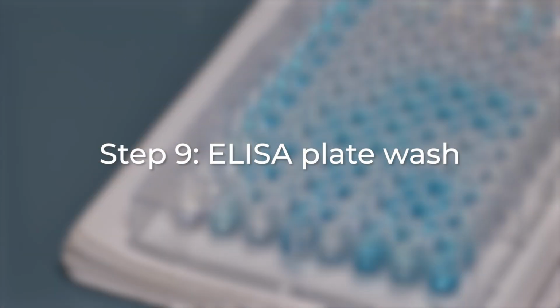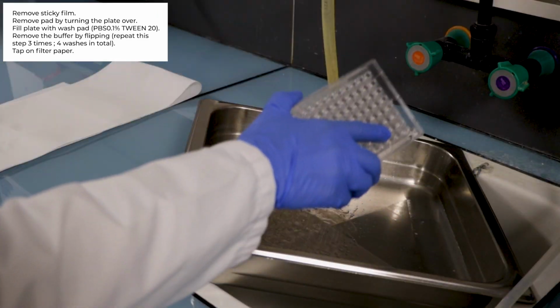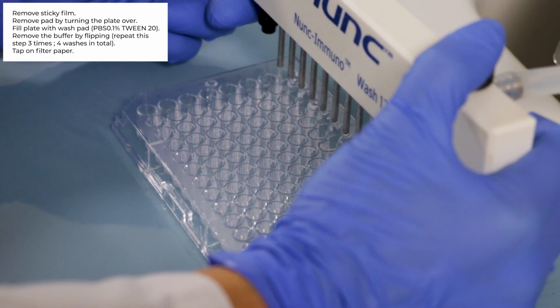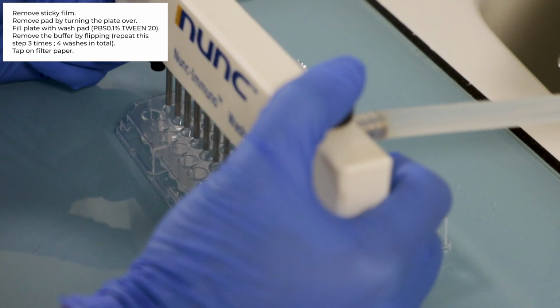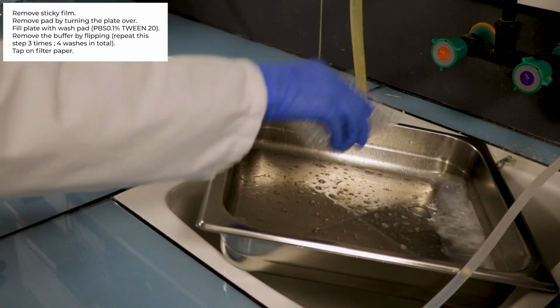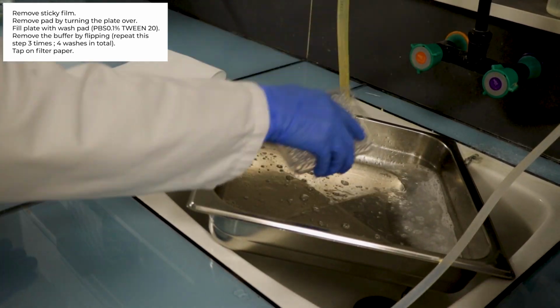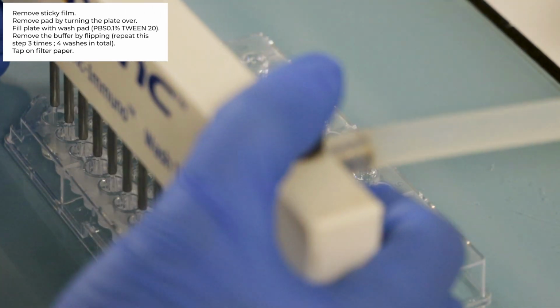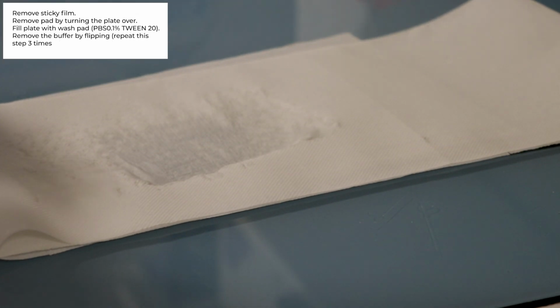Step number 9. Washing of ELISA plate. Remove the sticky film, discard the buffer. Fill the plate with washing buffer. Remove the buffer by flipping. Repeat this step 3 times for a total of 4 washes. After the last wash, bang on absorbing paper.